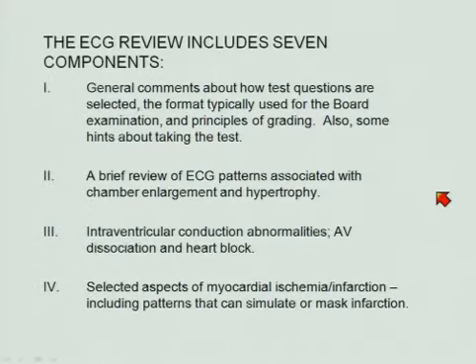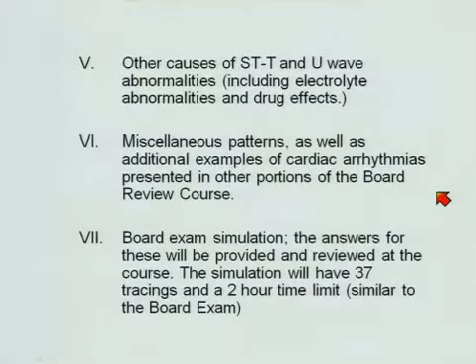Then intraventricular conduction abnormalities, AV dissociation and heart block, and selected aspects of myocardial ischemia or infarction, including patterns that can simulate or that can mask infarction. And then we'll talk about drug effects, electrolytes, and STT wave abnormalities, and some miscellaneous patterns and cardiac arrhythmia. The board exam simulation is similar in format to the examination administered by the board. That is to say, it has about 37 tracings and a 2-hour time limit.